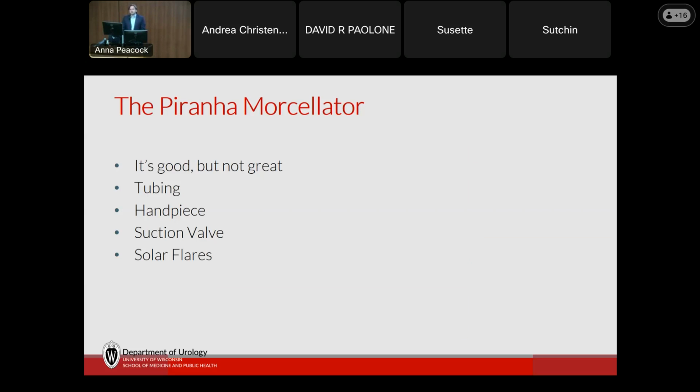You have to understand how the device works and where all the different pieces can fail. We had just Monday, Ali was there for that one, the O-ring. We thought we saw it in there in the handpiece. We're not getting any good suction, and it was there. It wound up falling out of view, and we just had to get another handpiece. You continue to learn new ways that this piece of equipment can disappoint, but it's still the best version of it out there, and you just have to own the different ways that it can fail and have a backup plan if it does completely.